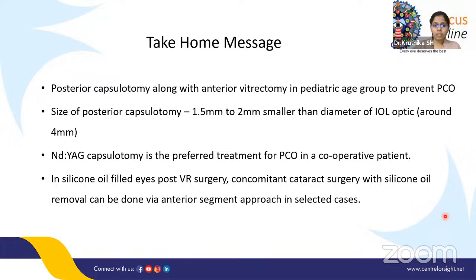And in silicone oil filled eyes after VR surgery, concomitant cataract surgery with silicone oil removal can be done via the anterior segment approach in selected cases. Here, selected cases means cases where the silicone oil is unemulsified. Where emulsification of silicone oil is already happening, we should always go via the posterior approach, because removal of all the silicone oil from the eye in case of emulsification is usually not possible if we do an anterior approach technique.